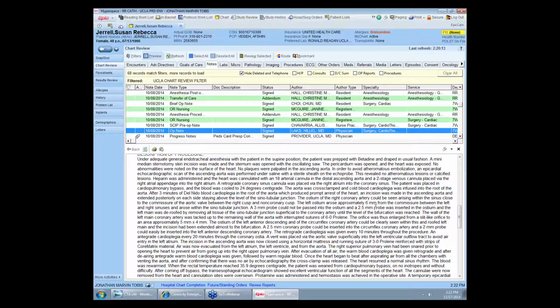Could be that the guiding catheter was advanced subselectively into the left main and opening it up, because the guiding catheter is very similar in profile to this artery. No, the guiding catheter was back in the aorta. You could see that on the ultrasound, so he had pulled it back, and it was just the ultrasound catheter coming out from the left main to the aorta.